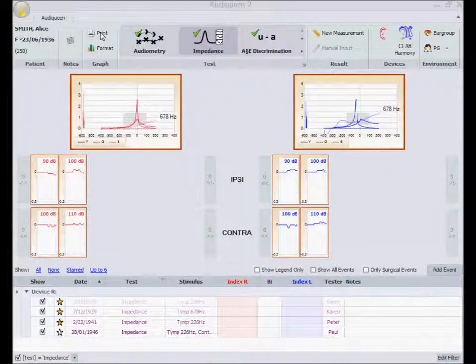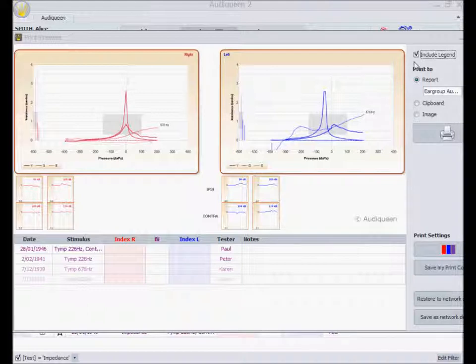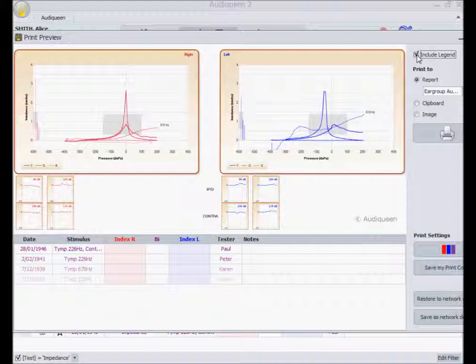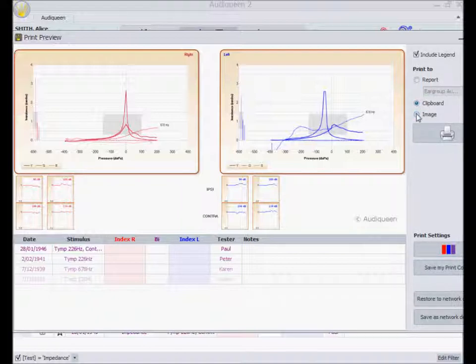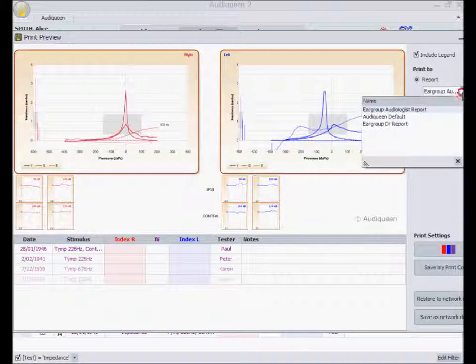There are several print options to print the graphs, either with a legend or without, to the clipboard, to a bitmap file, or to a Word document. I can use the default template or create my own templates.